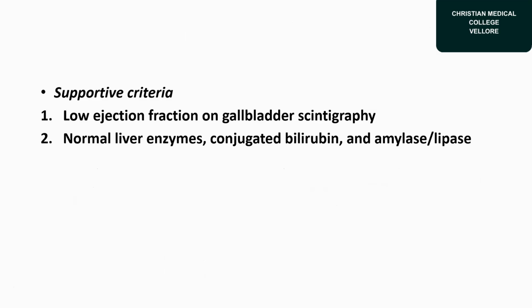And the supportive criteria for this is a low ejection fraction on the gallbladder scintigraphy and normal liver enzymes, conjugated bilirubin, amylase, lipase and all that. So this supportive criteria is where nuclear medicine comes into play, where we show the low ejection fraction on the gallbladder scintigraphy.